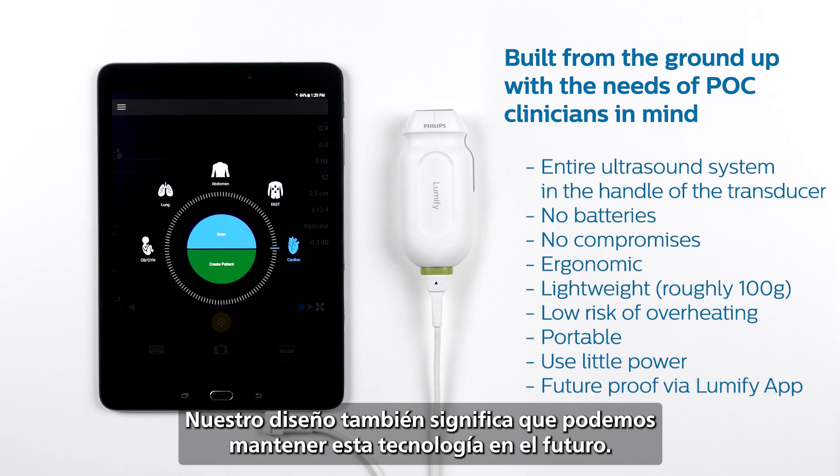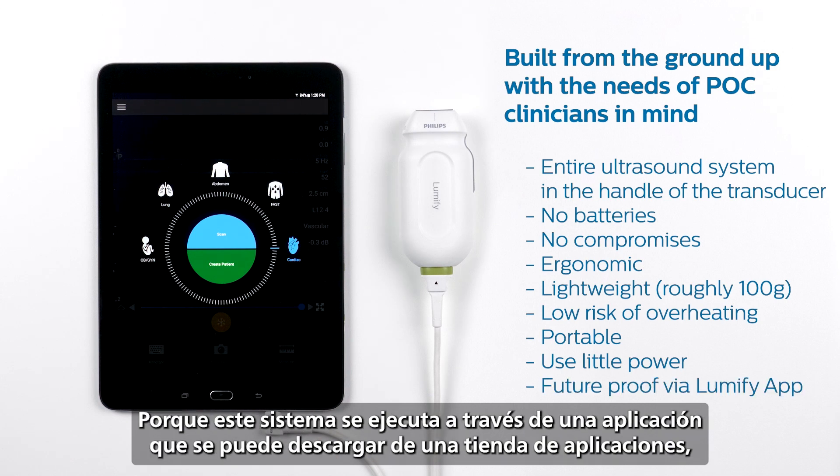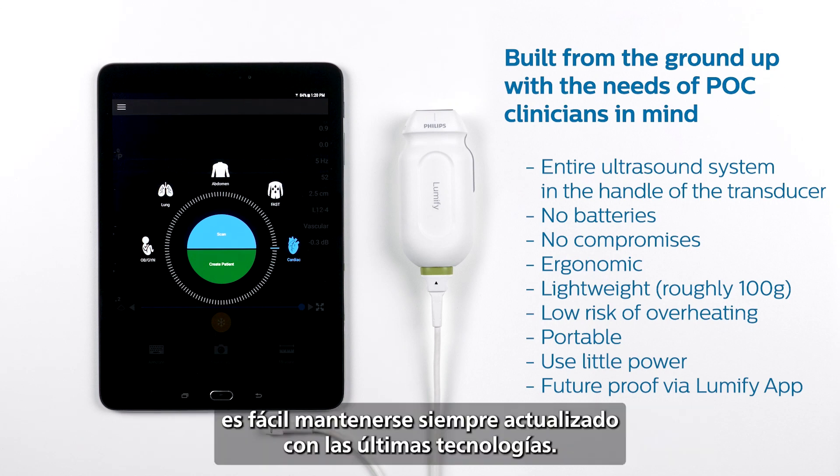Our design also means we're able to keep this technology future-proof. Because this system is run through an app that you can download from an app store, it is easy to always stay up to date with the latest technology.